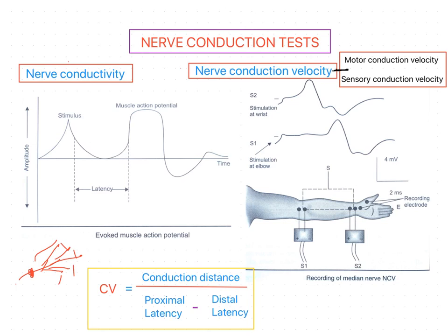If you look at nerve distribution, the distribution of the different nerves is subject to some variation between individuals, which may prove misleading in the assessment of nerve lesions. So the distribution of a nerve can be determined by stimulating the nerve trunk and observing the resulting muscle contractions.